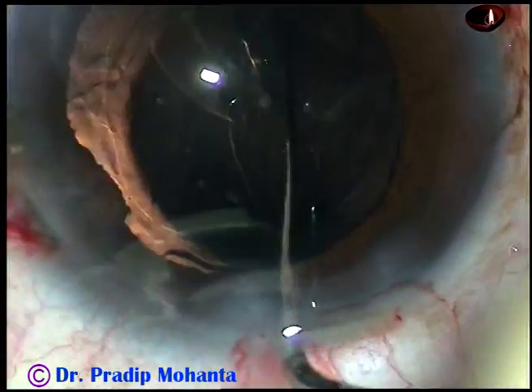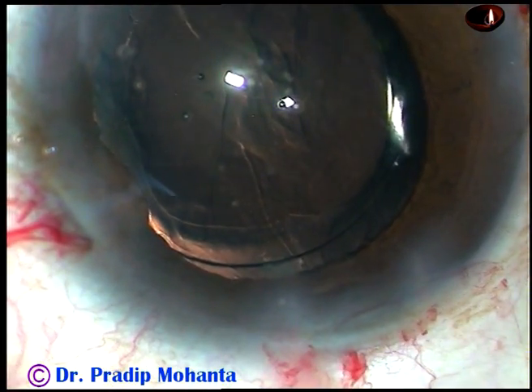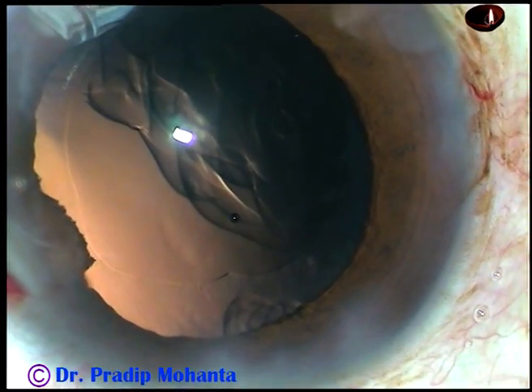Now the lens is oriented in such a way that the haptics are about 90 degrees away from the main incision.